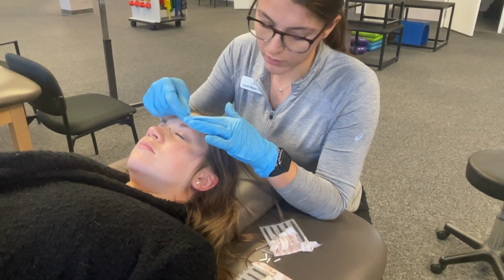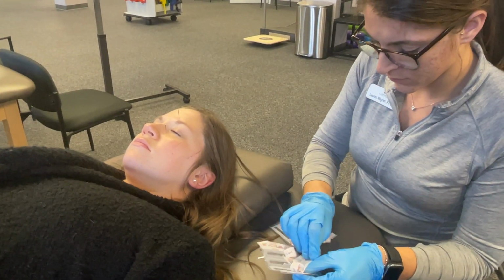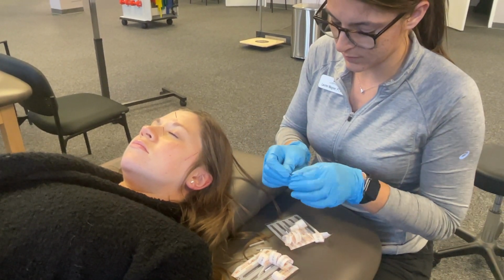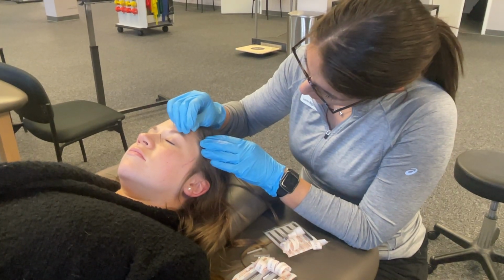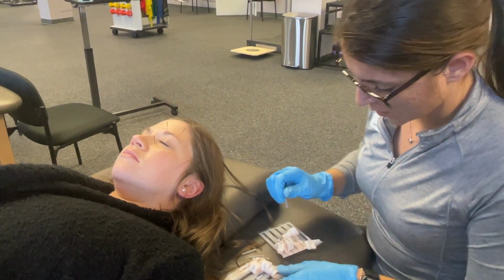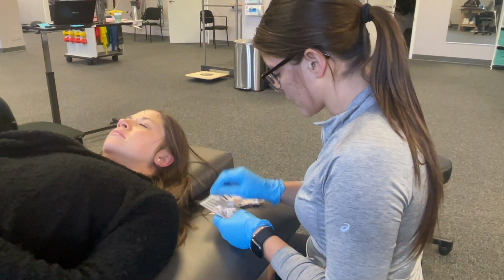Good, we hit bone pretty quick there. This is really good for headaches. And one more along that bone. Good.